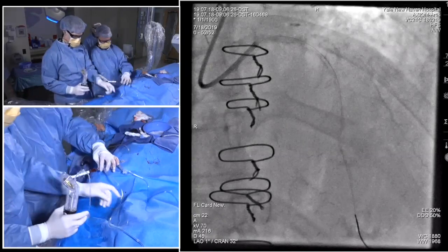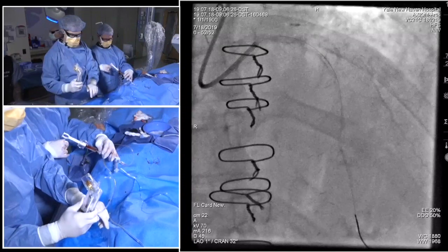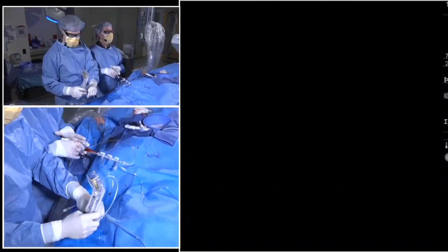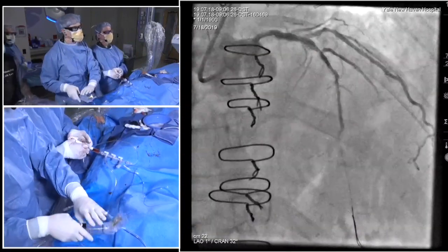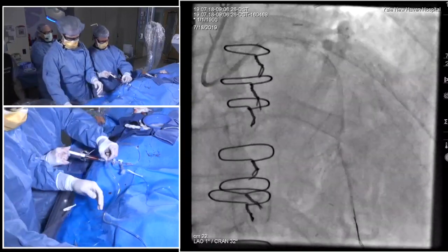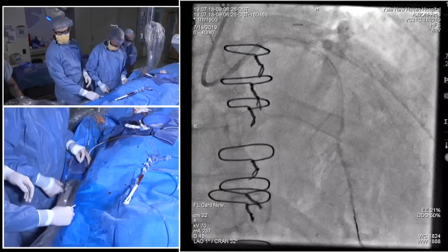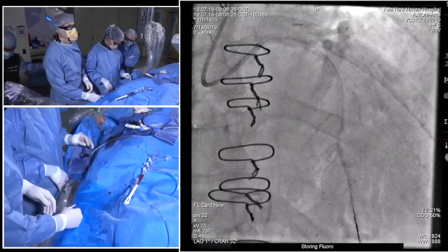So what are you guys doing now? Just going to image now. And it's getting better slowly. We're going to go down and image. Just show that picture again. You want to image first? Yeah. Make sure there's no split.